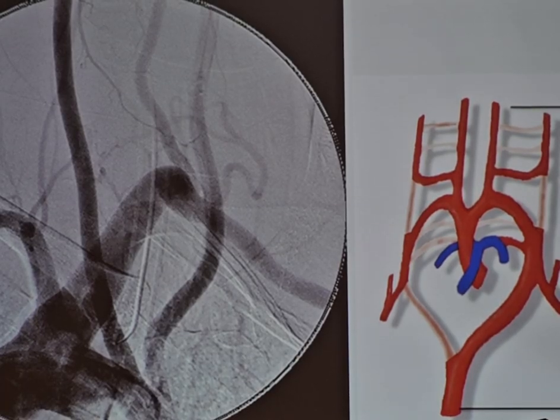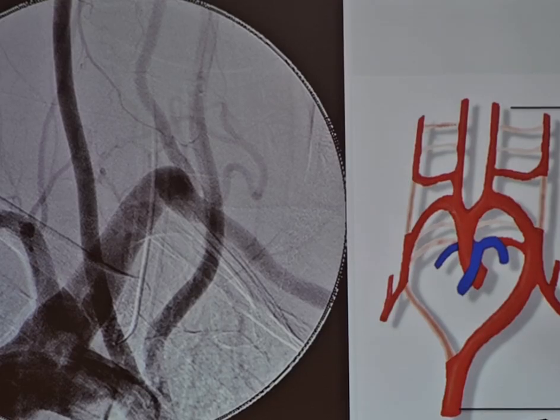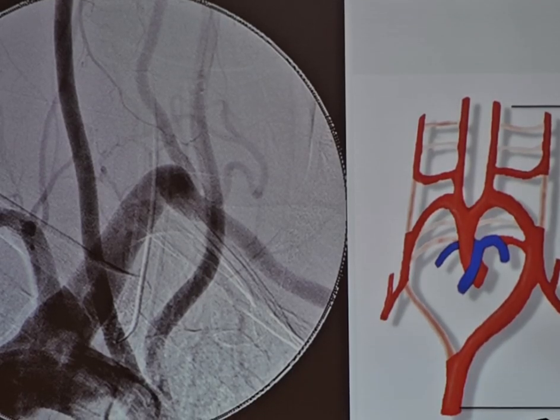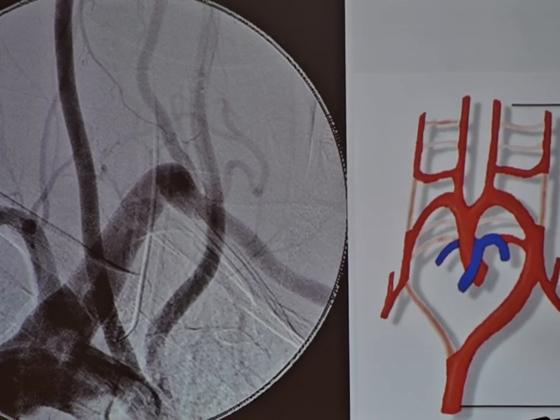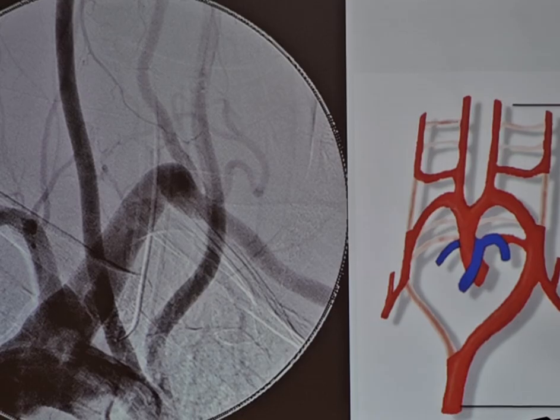Even if the reflux is in a safe segment, just above where the central retinal artery comes off, you have Onyx around your catheter in a non-straight segment. If you have Onyx around your catheter in a straight segment, you can always pull it out within about 20 minutes. But if it's in a bent segment, then you will force the catheter to straighten the vessel.